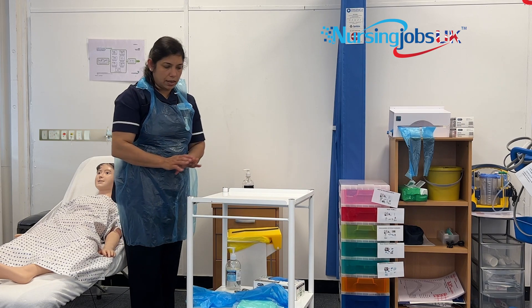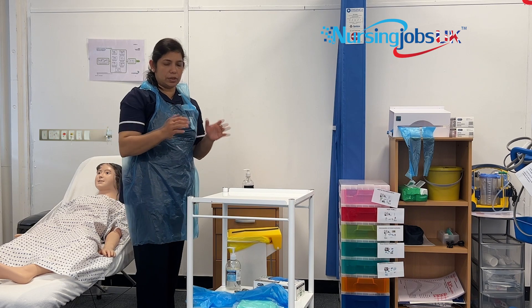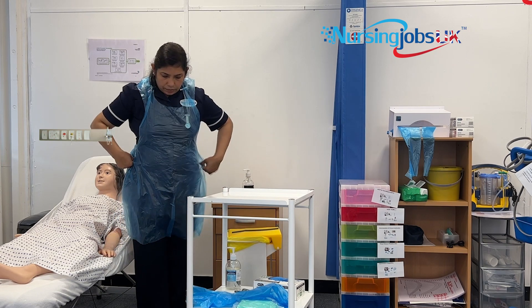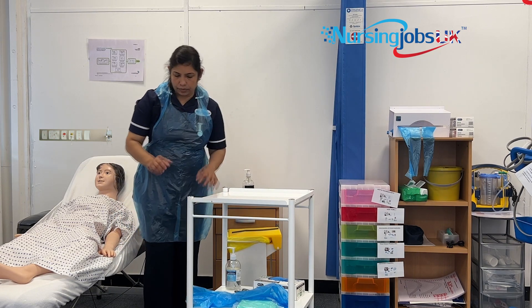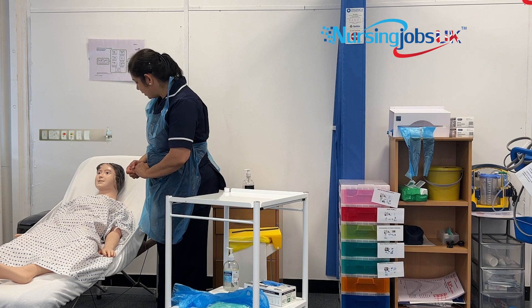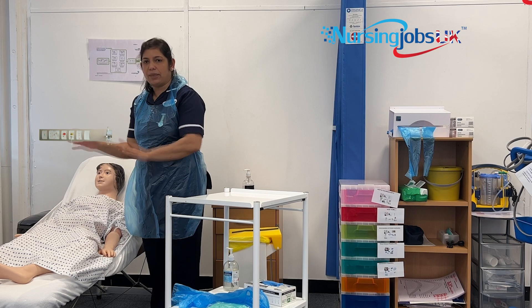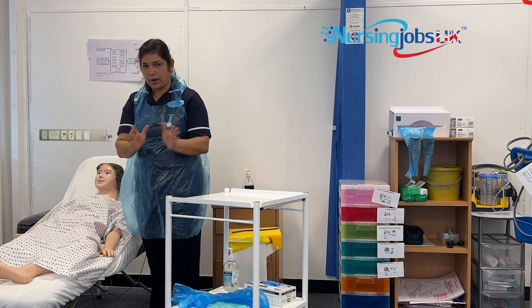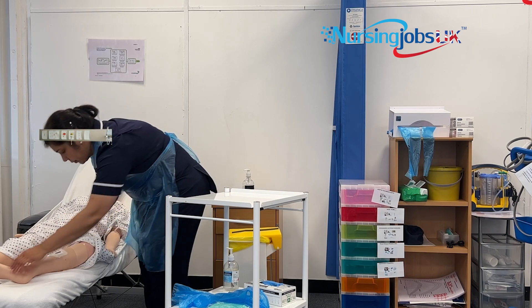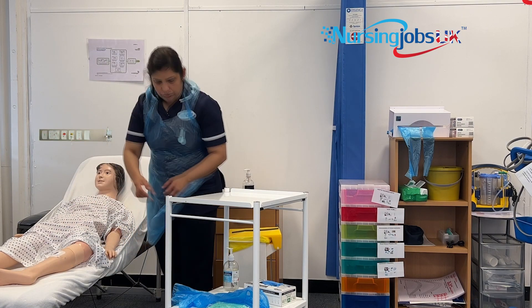If you feel that you've touched the curtain with your apron, you need to change it. Make sure the curtain is closed correctly. Joe, I'm back with all your equipment — can I go ahead for the dressing? Always make sure you are facing the patient. I'm facing the camera only because of the video. I'm just exposing a little bit, okay.